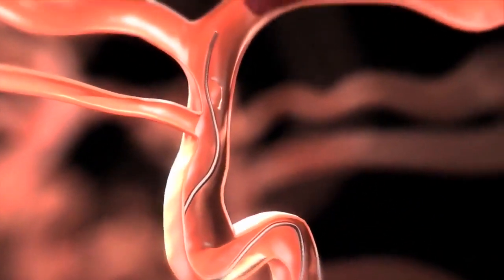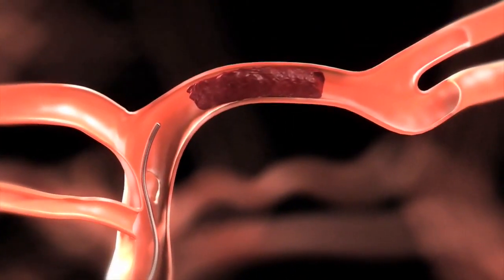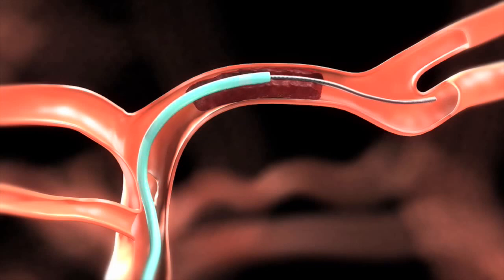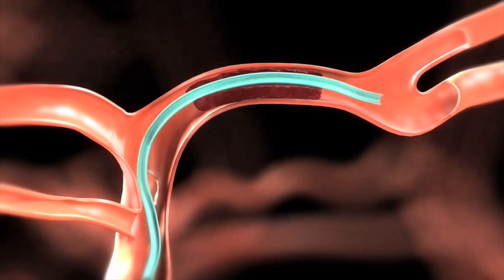Through that catheter, we take up a smaller catheter, a microcatheter, and we catheterize the arteries inside the brain, the carotid artery, and then into the middle cerebral artery. You can see the clot within the middle cerebral artery, which supplies blood to that half of the brain. So we bring up our microcatheter all the way up into the middle cerebral artery in the brain and cross the blockage.